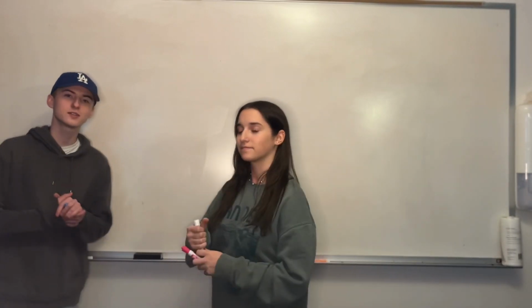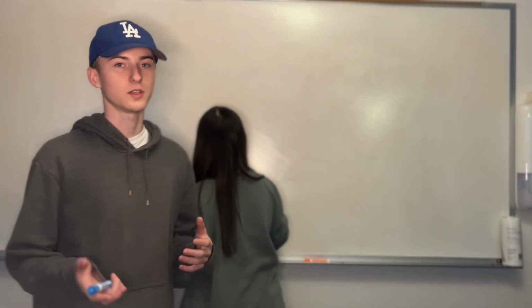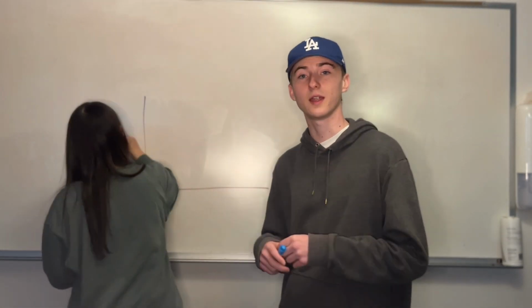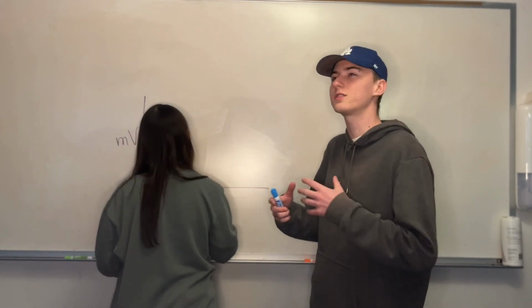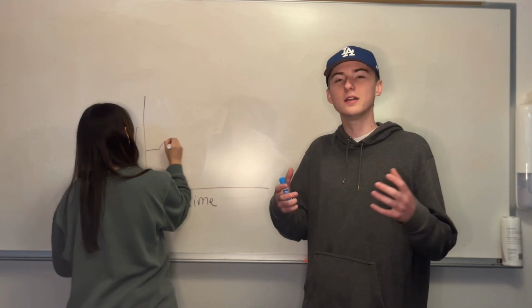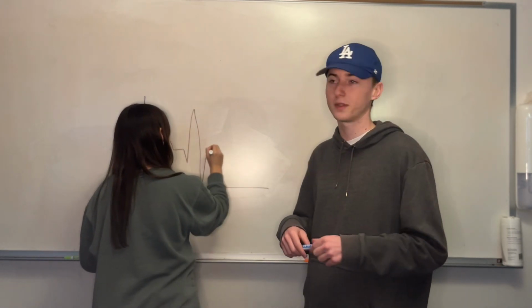Katie, can you go ahead and draw us an EKG? Now, let's think about what she's actually drawing. The instrument that we're going to use is the electrocardiograph, right? And the actual picture that we will see is the electrocardiogram. I know a lot of students think graph and they want to think picture, but think of the electrocardiogram as being like on Instagram when you post a picture.